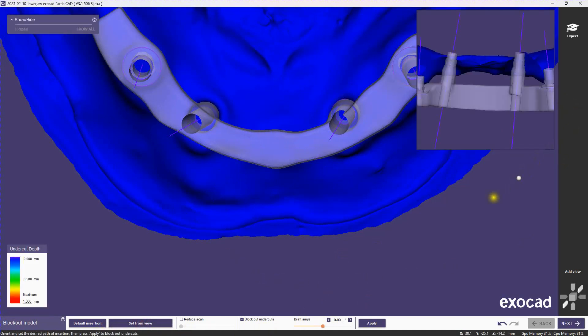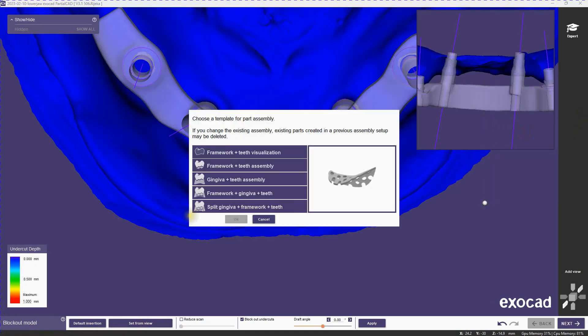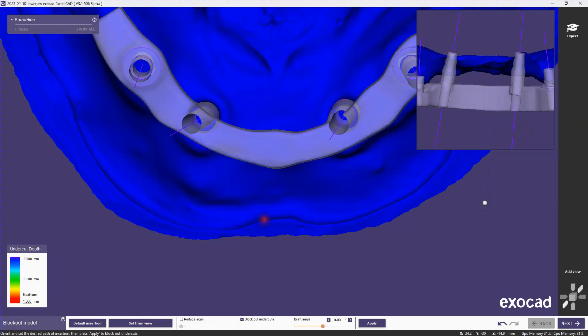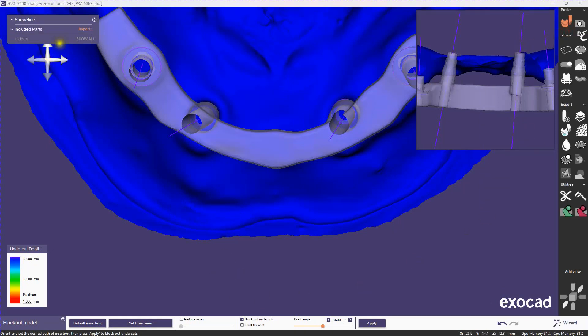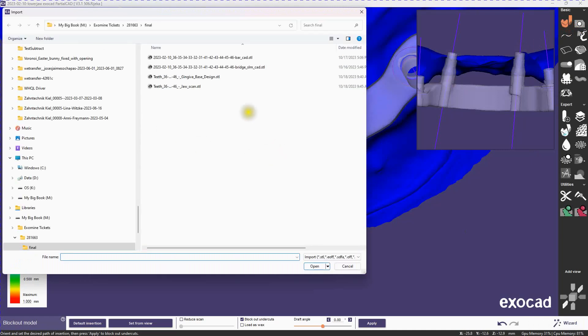Now we're going to trick it into doing a quick snap workflow. We're just going to create a part assembly and do our split gingiva. And then we'll have to import the remaining parts, which in this case will be the bridge and the gingiva.